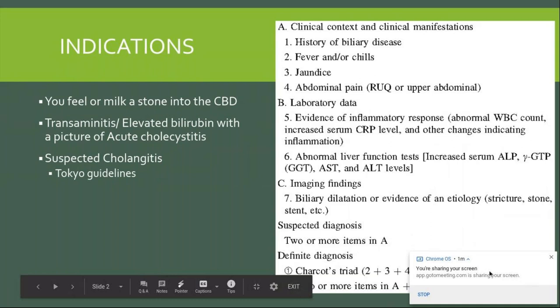Duct, and then showing the right and left hepatic radicals filling the common bile duct. I'm specifically looking for any filling defects within the common bile duct, sometimes within the hepatic radicals, unfortunately. And then I want to see filling into the duodenum, so there's no blockage at the end of the common bile duct from the ampulla into the duo. So this is a really good example of what looks like a Kumar clamp with the needle into the cystic duct and getting all five of those things. And I don't see any filling defects in this specific IOC.